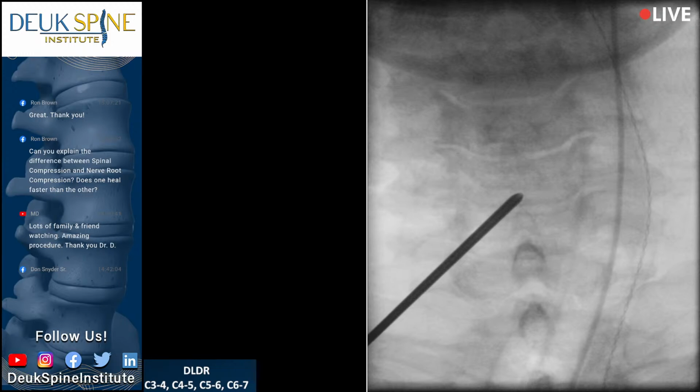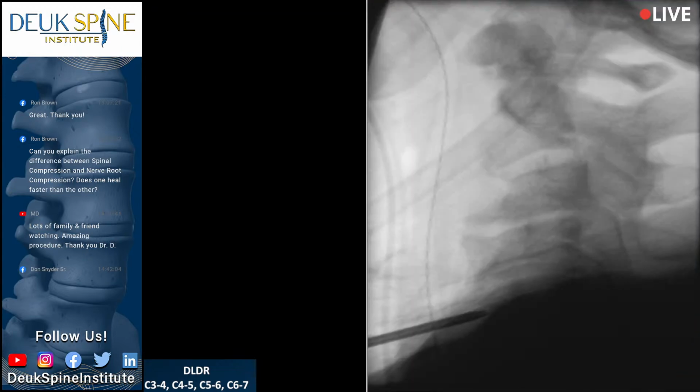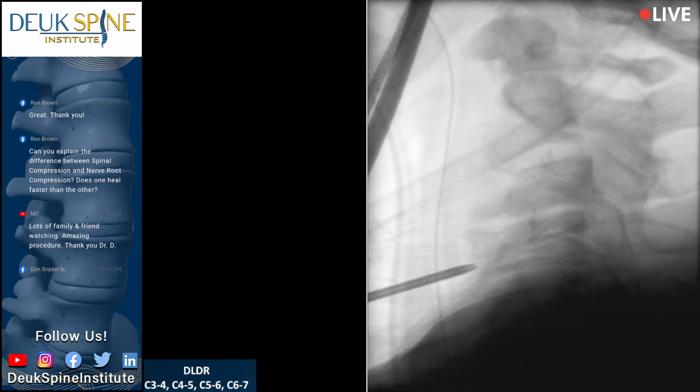Well, for those of you watching, this is the patient's face. He's looking up at you. This is his neck. The middle of the neck is right about here, where my finger is, up and down. His chin is right there. His chest is here. Is that my shot? No. Yeah, go ahead and do a shot. All right, yeah, 2, 3, 4. So I'm very close. Shot? No, that's not. No. Shot? All right, let me get an AP.